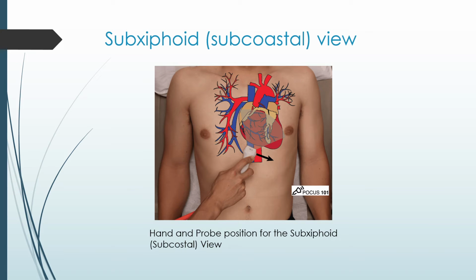This is the last view, the subxiphoid view. The subxiphoid, also known as the subcostal view, allows you to see similar structures as the apical 4-chamber view, but just approaches from a different angle. The subxiphoid view is useful when you are having difficulty getting adequate parasternal views, or when you are evaluating a trauma patient when doing the FAST scan.